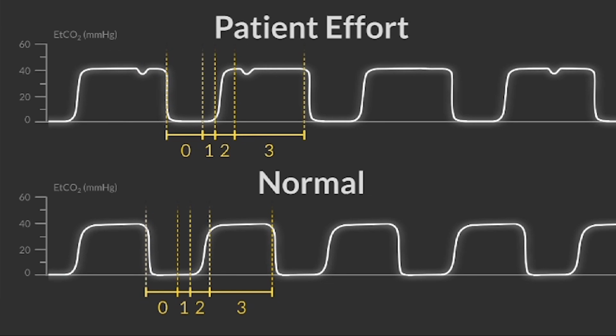Next, we're going to look at detecting patient effort with the capnogram. In addition to looking at the pressure, the flow, and the volume waveform for detecting patient effort, you can look at the CO2 tracing as we have here.